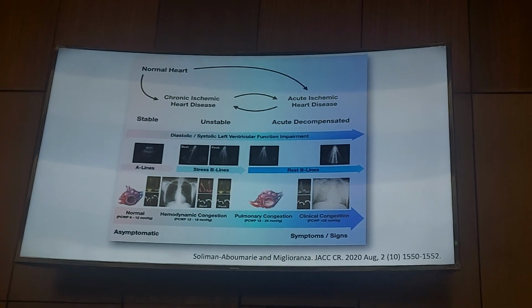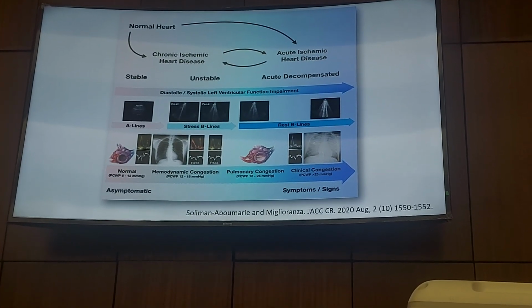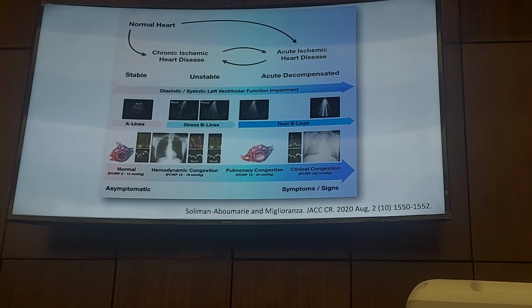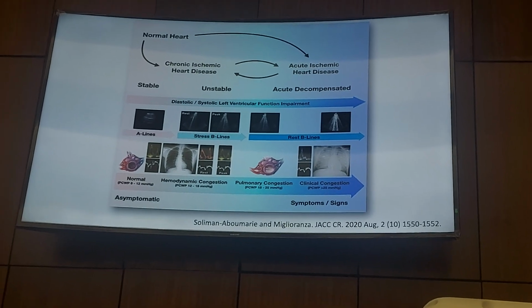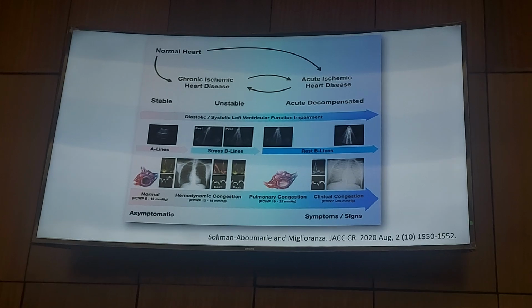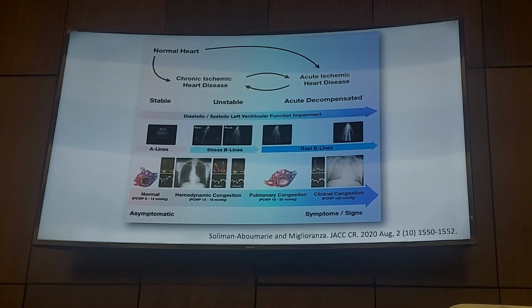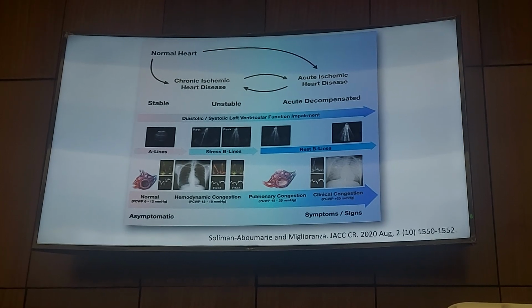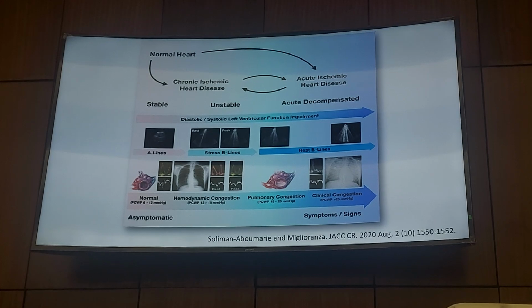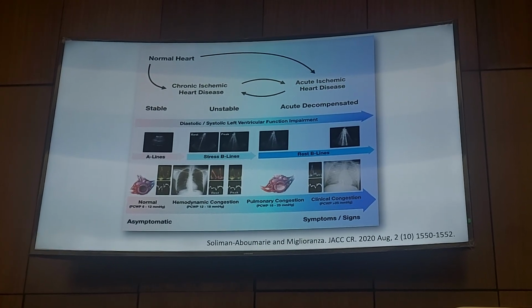So the message when they published this case was that lung ultrasound can save lives by giving an early indicator of very high LVEDP in the absence of typical ECG or typical history or typical troponin rise. And also now lung ultrasound is part of the stress echo protocols. You can detect the appearance of B lines very early when you exercise the patients, whether pharmacologically or with physical exercise. And you see the B lines before the patient becomes breathless, before the patient becomes hypoxic, and before any ECG changes.